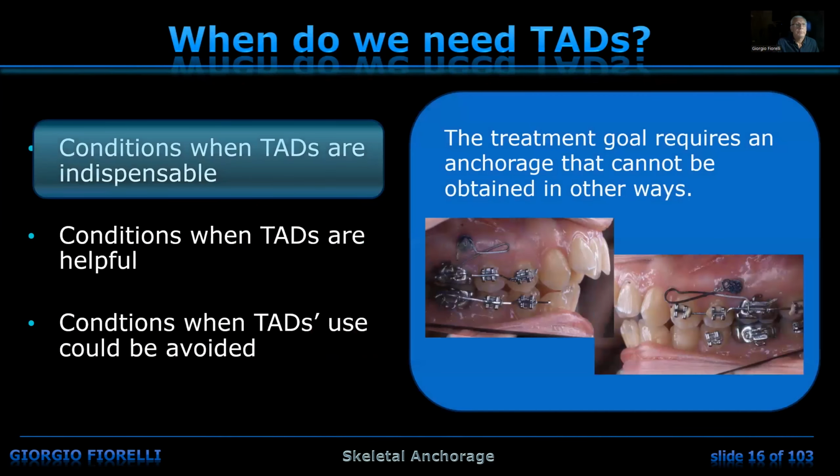So I would say that there are conditions where TADs are really indispensable. I mean, you cannot obtain your goal without it. And one good example could be posterior teeth intrusion. I do it in one way, other doctors do it in a different way, but in any case, you cannot do an intrusion of 6 or 8 posterior teeth without a skeletal anchorage.